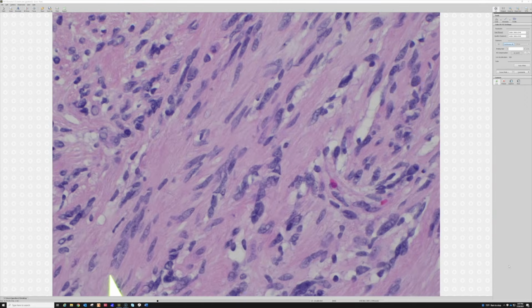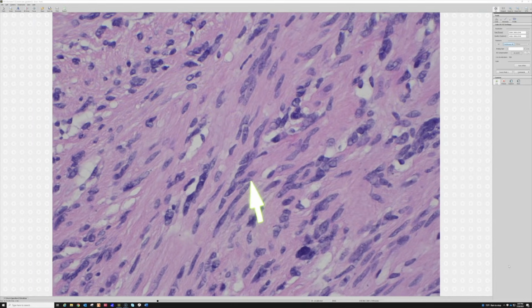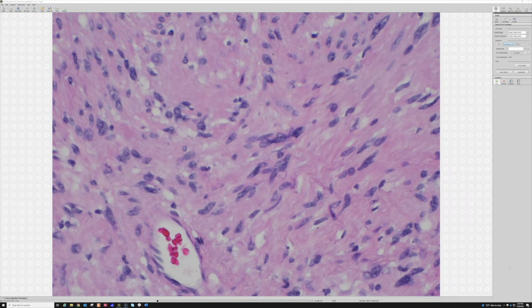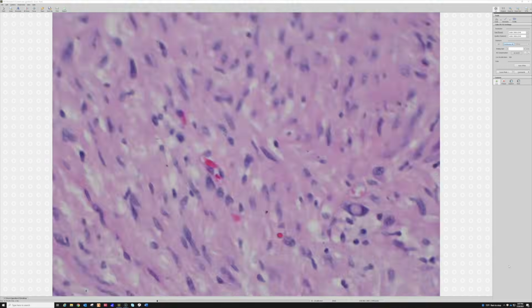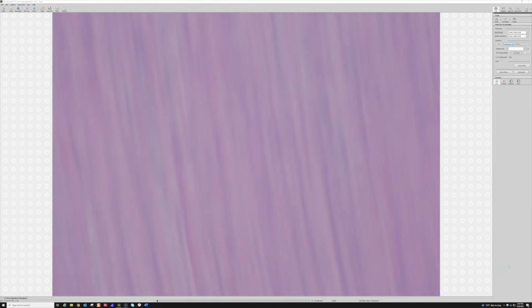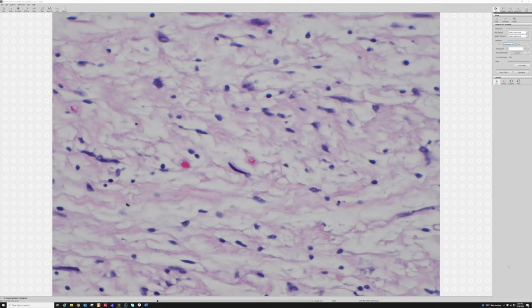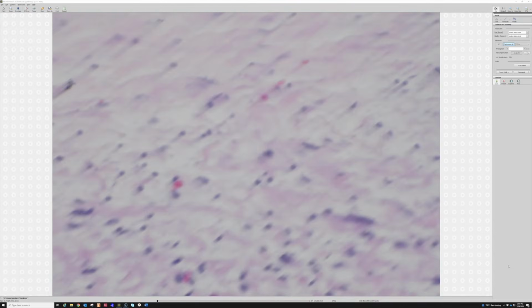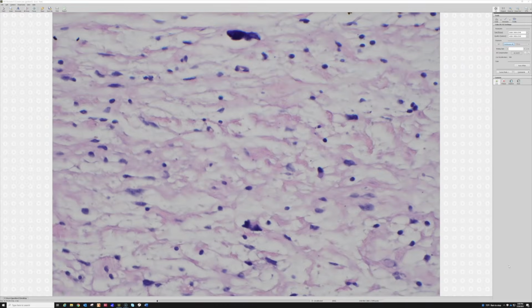I admit it's very subtle, but sometimes those subtle things, seeing the little chain of nuclei, the flat end and then the rounded end, can really make me think, ooh, maybe this is neural, if it's a hard case. The other thing that they do is they sometimes have kind of an S shape or a bent or buckled or crooked shaped nucleus. And I'm trying to find a good one of those. So that one, right? It's not perfectly straight. It's kind of curved a little bit like a boomerang maybe. And sometimes they're curved even more, like if you took the top of a can of soda or Coke and you popped it, that little tab that you pop, instead of being flat, it's bent in the middle. And I think a lot of times Schwann cell nuclei look that way.